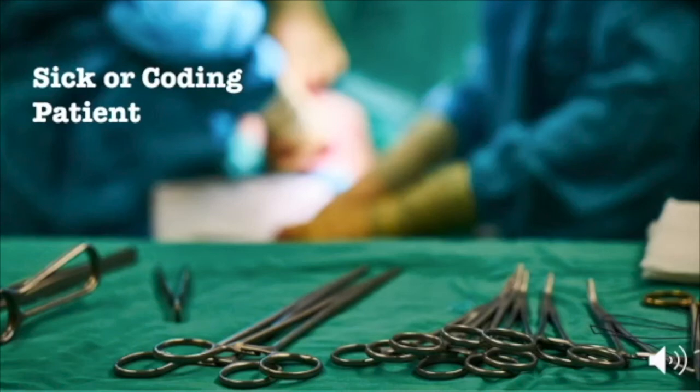So we've spoken about unstable arrhythmia and stable arrhythmia. Now let's go to the biggest of all, the cardiac arrest. Let's say you show up on scene and the patient's actually in cardiac arrest. Again, this isn't going to be that difficult. You're going to treat them the same way as any other patient in cardiac arrest with the standard ACLS guidelines. You practice these a lot, so you should be pretty good at them.